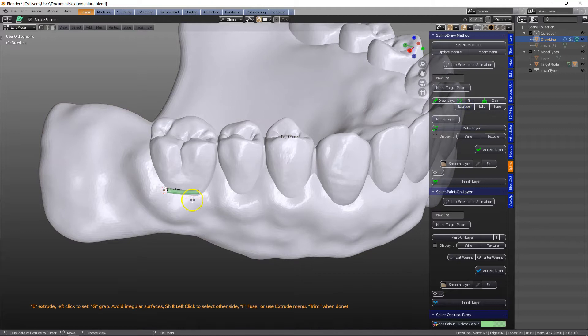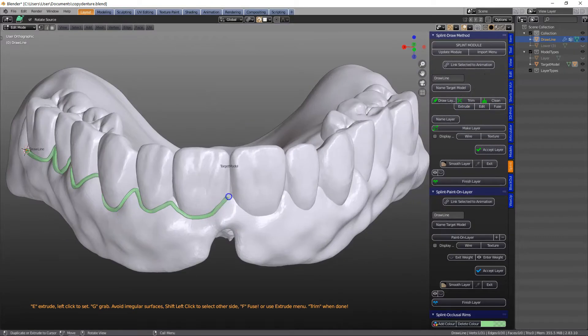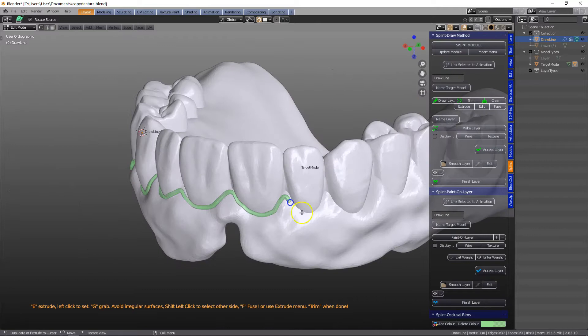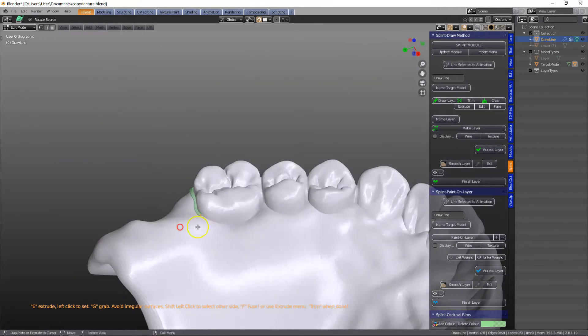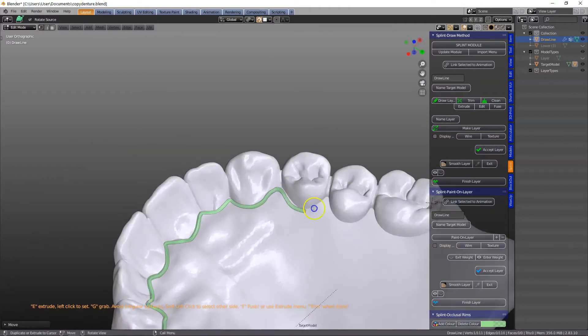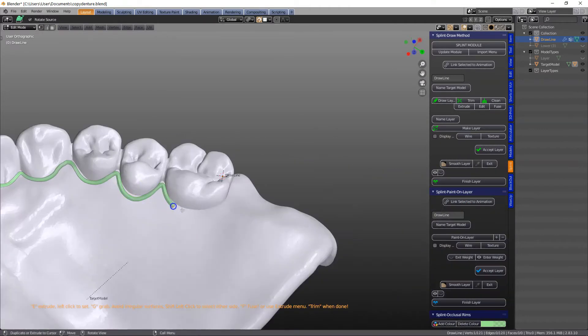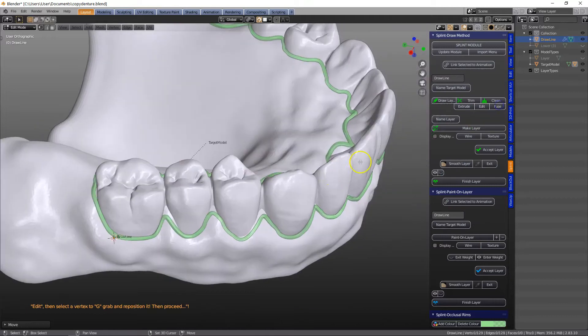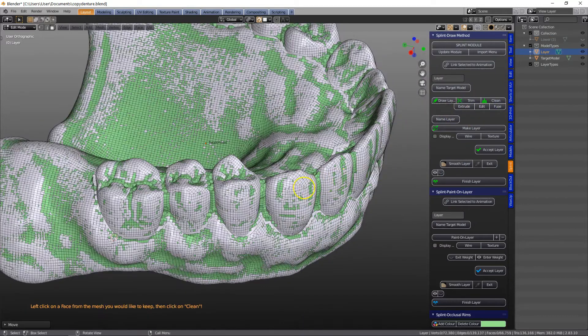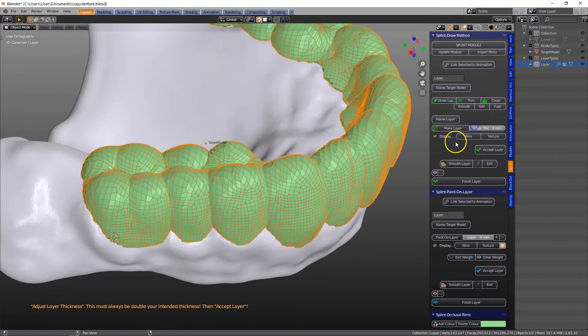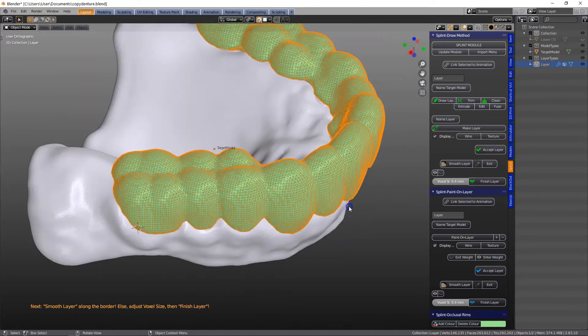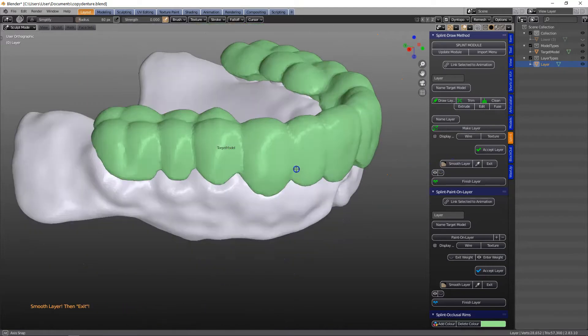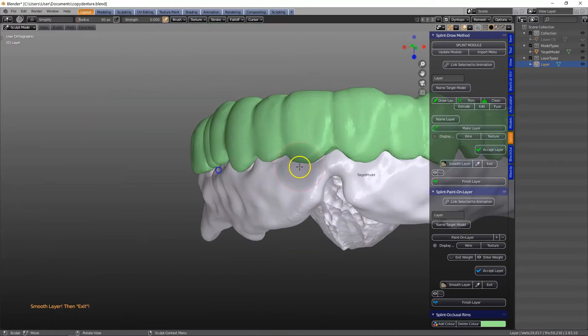So I'm going to click extrude and just fast forward it quickly. Perfect, fuse the line, trim it, and then clean the mesh. Then we're going to make a layer and accept it and I'm going to smooth it, just smooth the border.